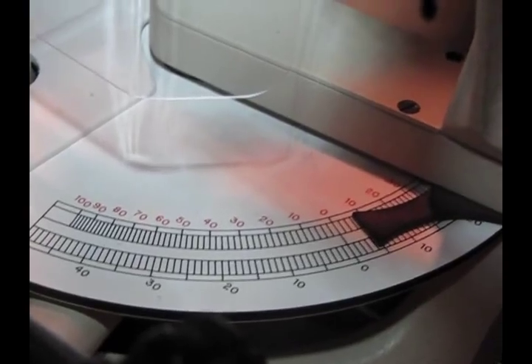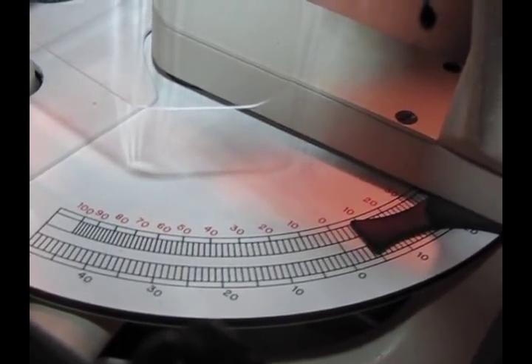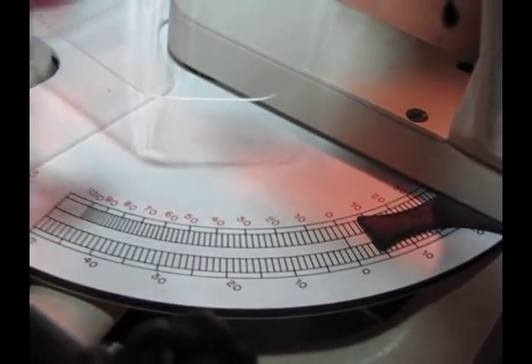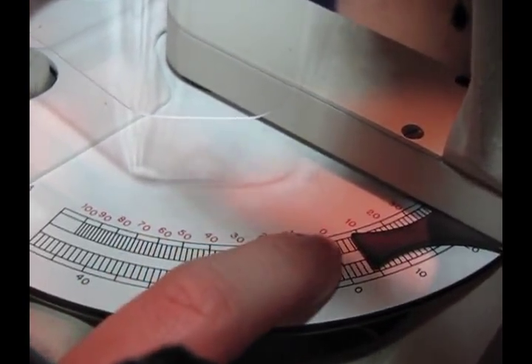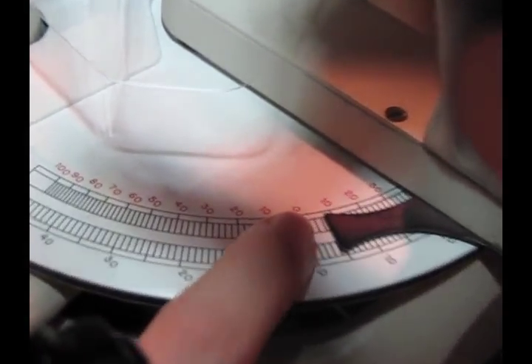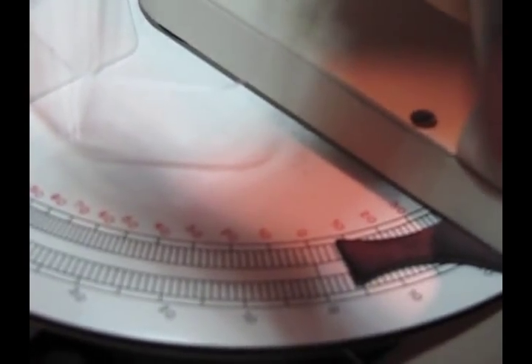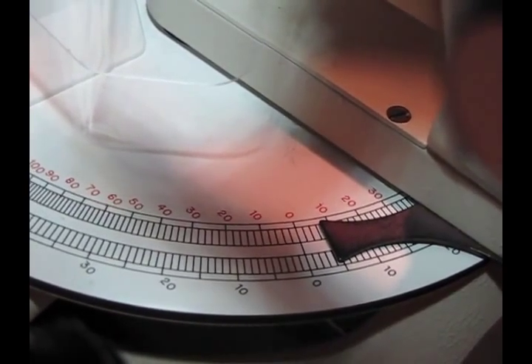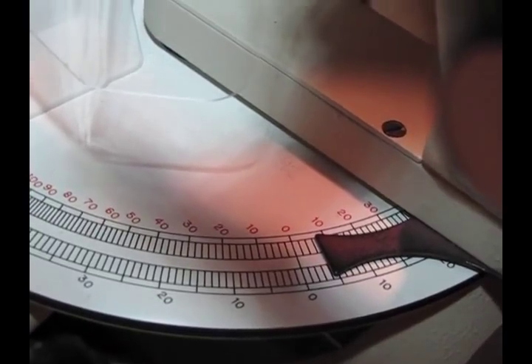So we're going to remember to look at the red scale. And if you forget, there's going to be a little triangle telling you that it's red for prism diopters. Every little hash mark represents 2 prism diopters. So we got 2, 4, 6, about 7. It's on the side of her. So it's 7 base in, and that's your objective angle.